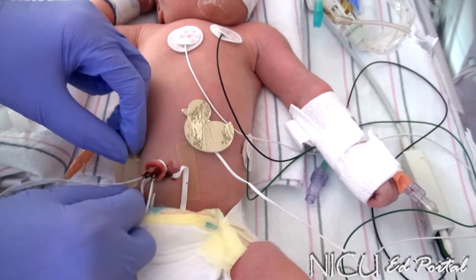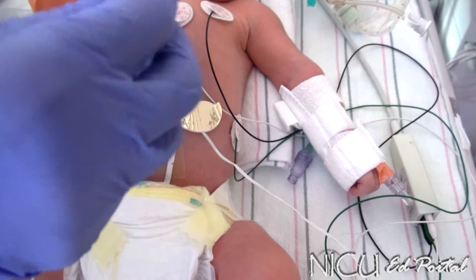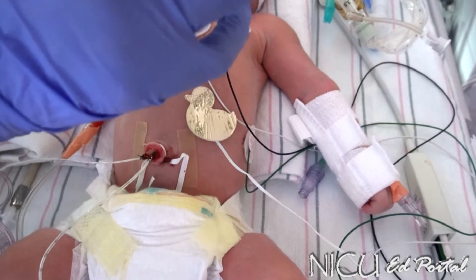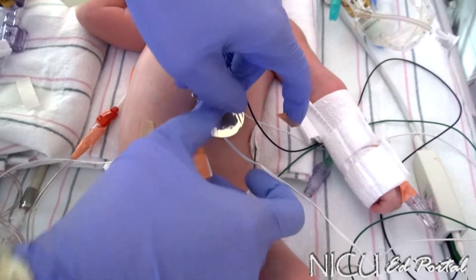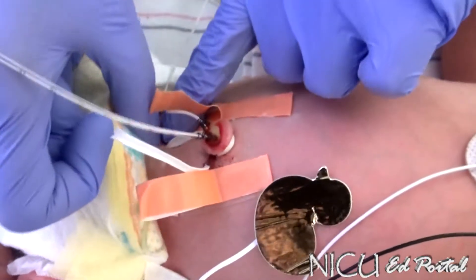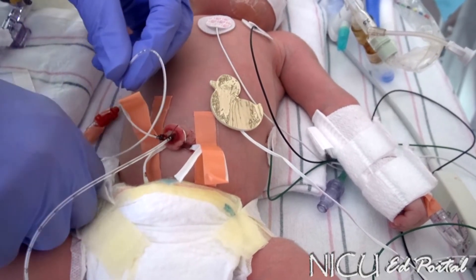Then we have two goal posts that we make. Sometimes you have to kind of correct them as you put the baby together. We tie or wrap each one separately because they usually come out.